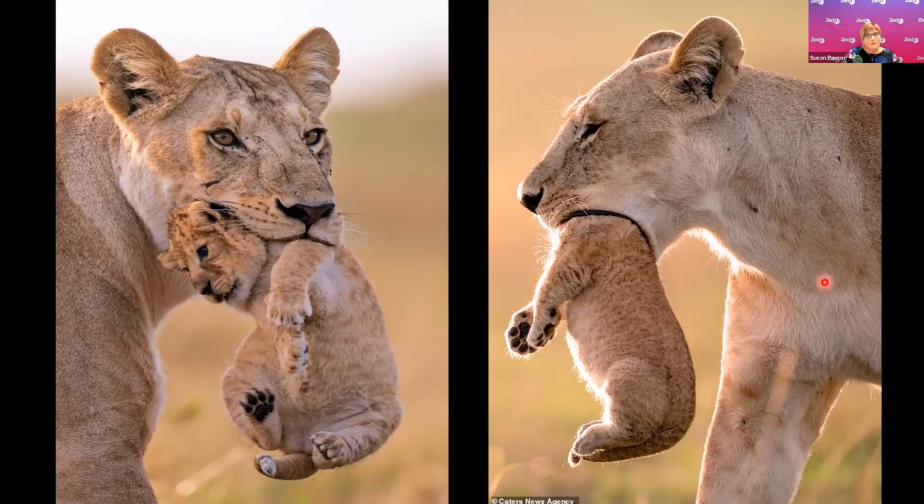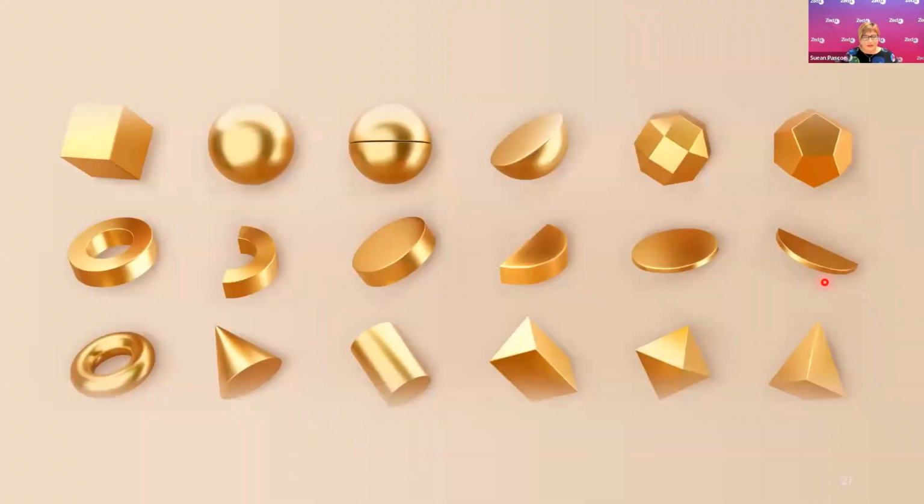And where possible, you may try to scan from a different window as well. So try from different angles to see if you can see the foreign body better. Remember that, particularly with metal objects, we see our objects best when we hit them at 90 degrees. So we need to try and get perpendicular to our foreign body. And sometimes that might be from a different angle to the entry wound. By scanning in the two planes, we build up this three-dimensional picture and we can work out what shape the foreign body is.